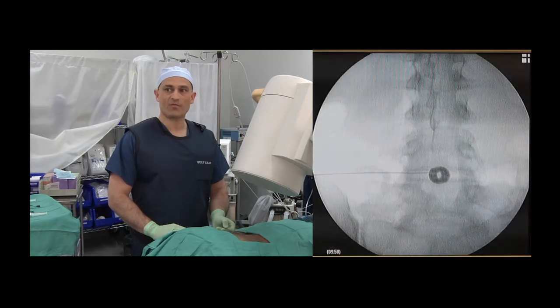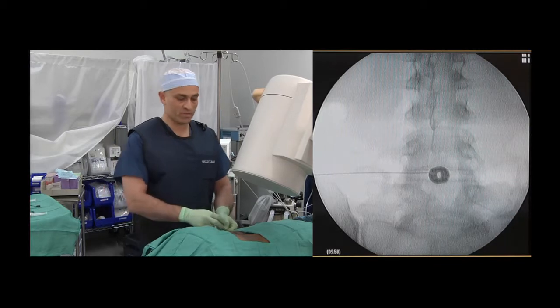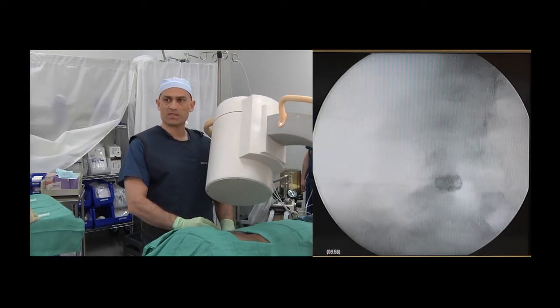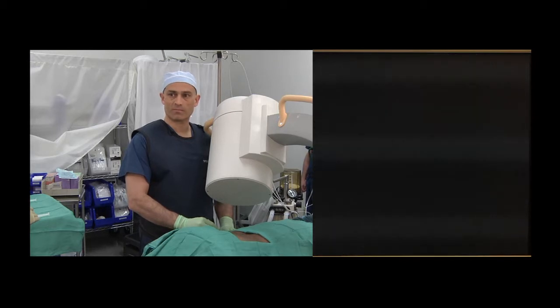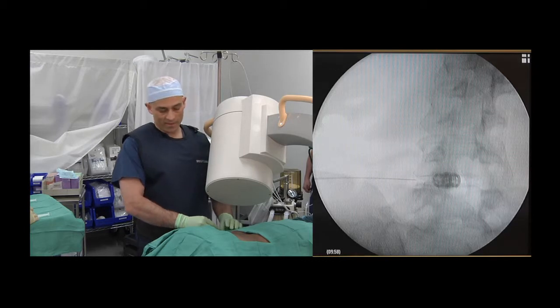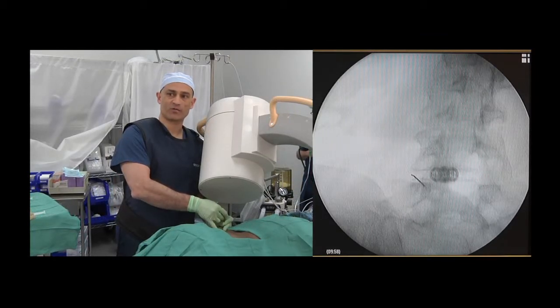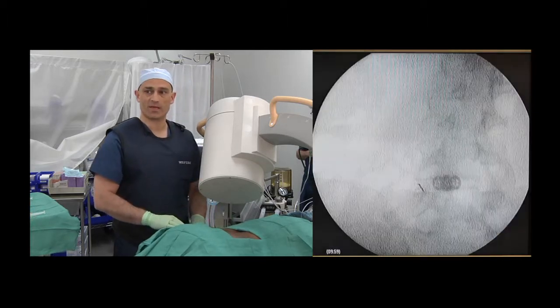The needle is lying over the L5-S1 intervertebral space. The X-ray technician is then asked to rotate the C-arm into an oblique view to approximately 20 to 25 degrees. The needle tip can be seen overlying the neuroforaminal space, and then under fluoroscopic guidance, the needle is inserted through the skin and advanced under fluoroscopic control into the neuroforaminal space.